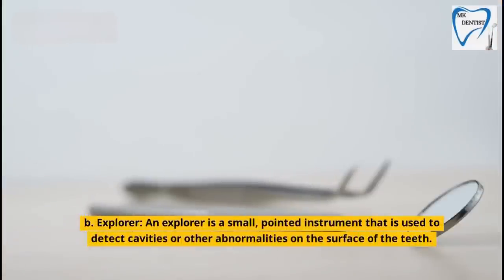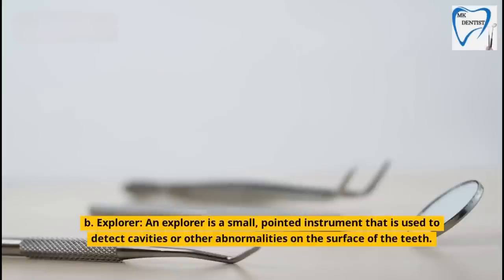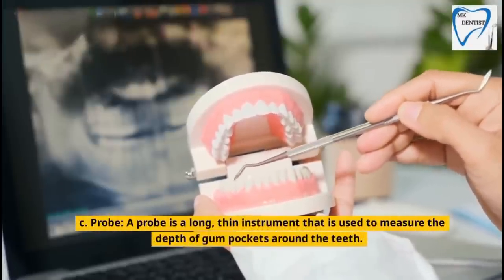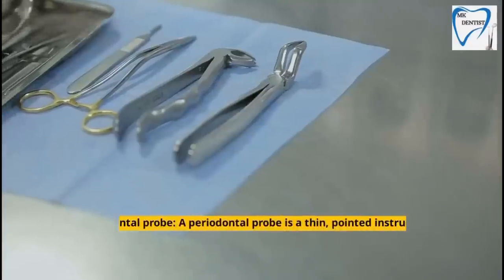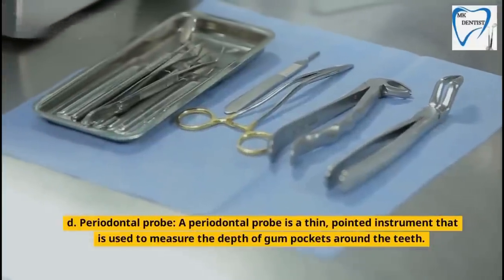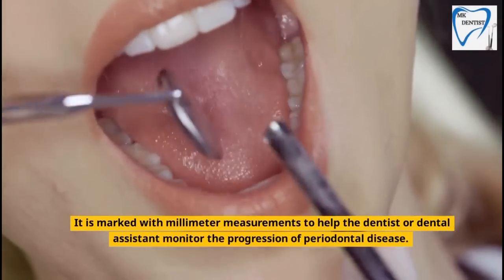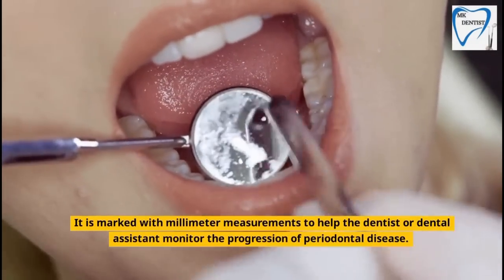B. Explorer — An explorer is a small, pointed instrument that is used to detect cavities or other abnormalities on the surface of the teeth. C. Probe — A probe is a long, thin instrument that is used to measure the depth of gum pockets around the teeth. D. Periodontal Probe — A periodontal probe is a thin, pointed instrument that is used to measure the depth of gum pockets around the teeth. It is marked with millimeter measurements to help the dentist or dental assistant monitor the progression of periodontal disease.